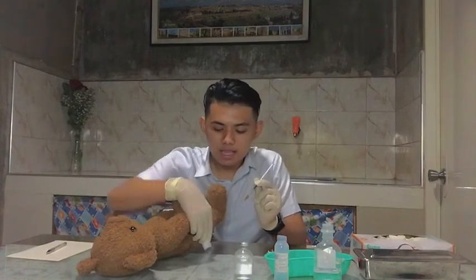Pull the skin approximately 1 inch to the side. Under some circumstances, such as for an emaciated client or an infant, the muscle may be pinched. Holding the syringe between the thumb and the forefinger as if holding a pen, pierce the skin quickly and smoothly at a 90-degree angle. This is to ensure insertion of the needle into the muscle.